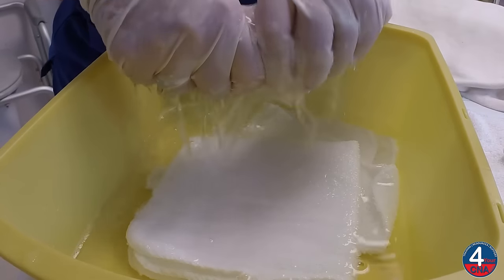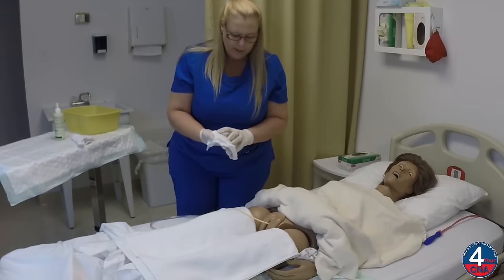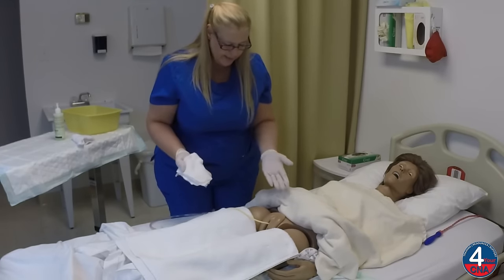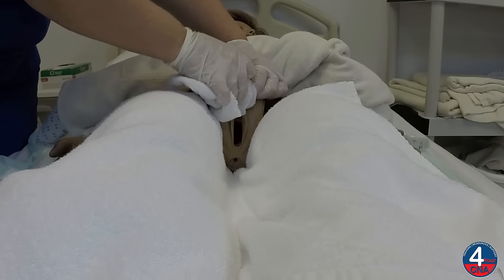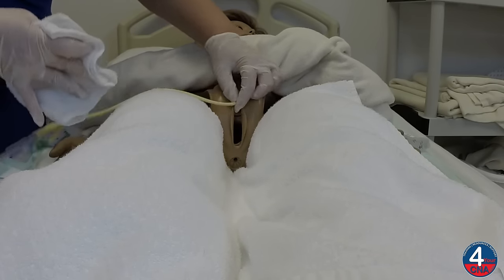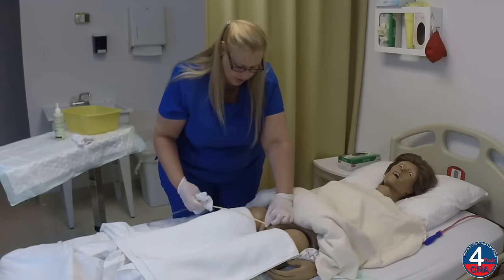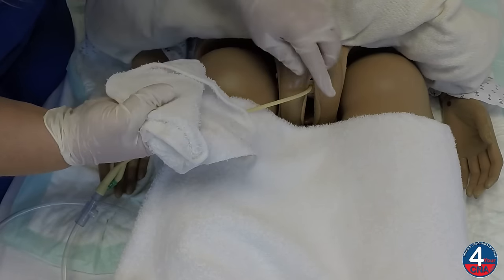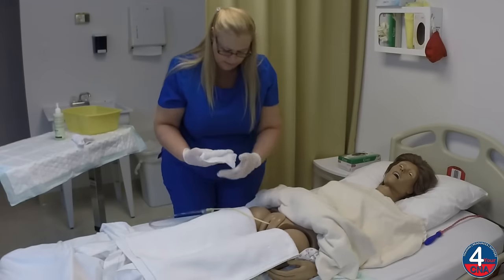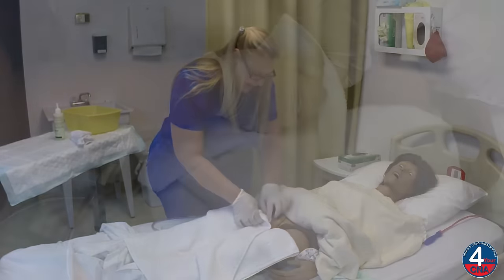Whenever we wash, we must rinse. So I'll wring this washcloth out and use it to rinse that catheter the same way we washed. I'm going to hold it where it exits the body, wrap the washcloth around, and wipe away from the body. We'll do this four times: two, three, and four. Set this aside. Now we'll dry the catheter.